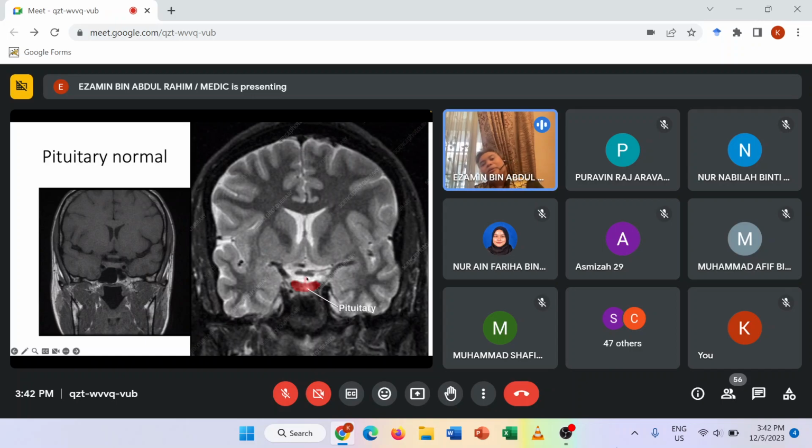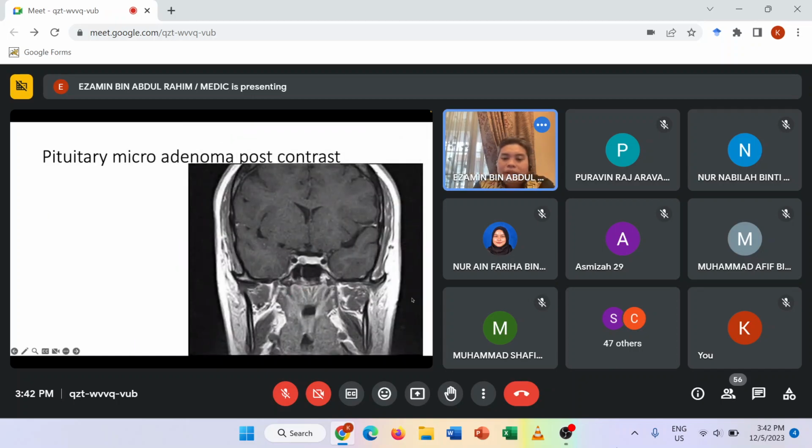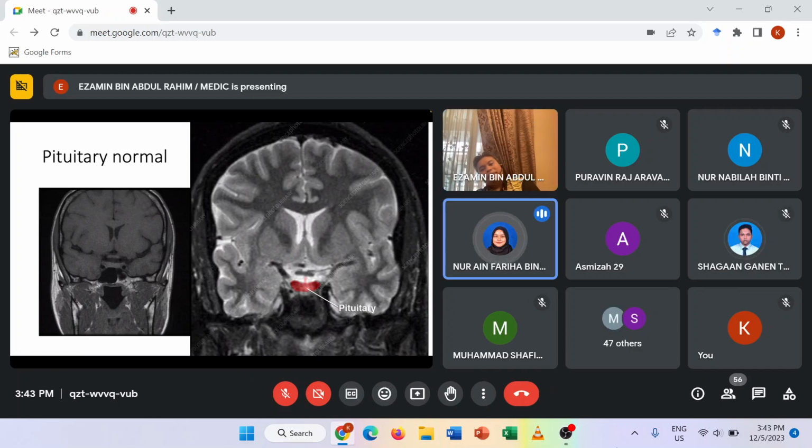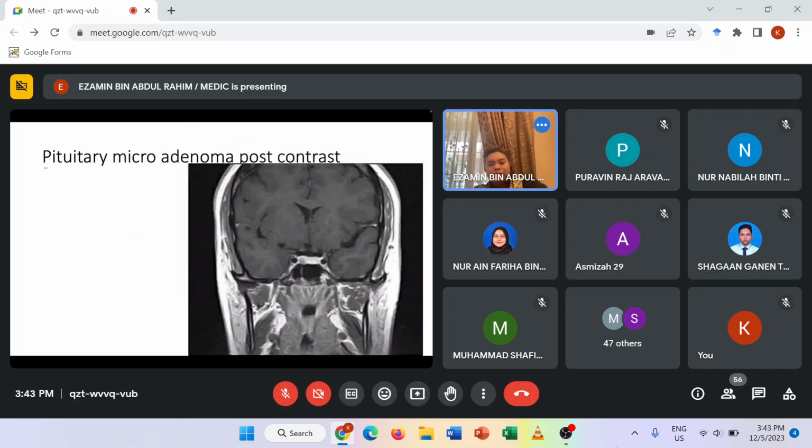This one, they really took the image, I mean the cut at the stalk area. Otherwise you won't even see it. Alright. Okay, and then you must give contrast to know. This one is non-contrasted. See, this one is T1. This is a T1 image like this. T1 grey matter, grey outside, grey is grey, white is white. Okay, this one is T1. Do you hear me? I mean, do you all understand? Alright? Still alright, doctor. Tell me if you are very sleepy or bored.